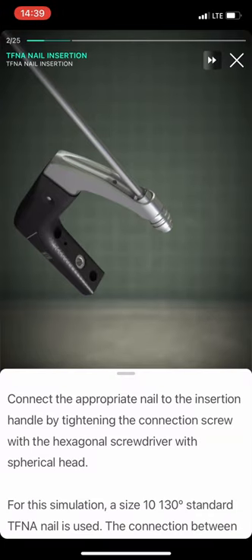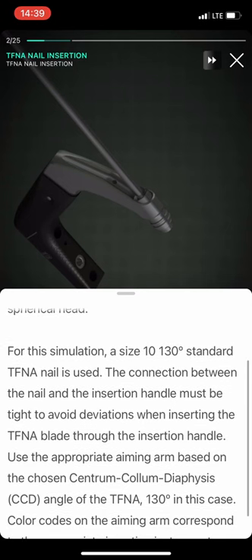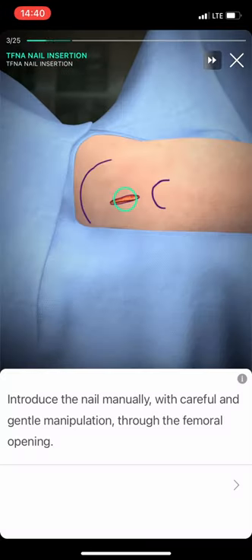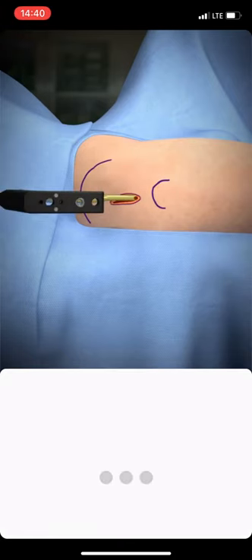Connect the appropriate nail to the insertion handle by tightening the connection screw with the hexagonal screwdriver with a spherical head. Introduce the nail manually, with careful and gentle manipulation, through the femoral opening.